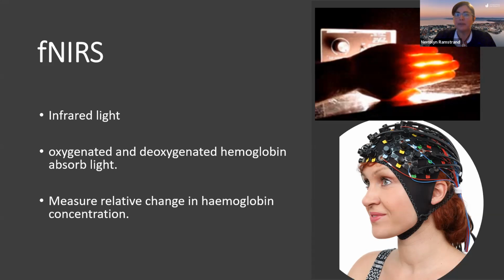And there's a formula that we can then use to look at relative changes in the hemoglobin concentration in the brain. So essentially, through a formula, by measuring blood flow in the brain, we can see how much activity there is in certain areas of the brain. And we can model that. So depending upon where I put these probes on the brain, I can model activity dynamically in the brain.